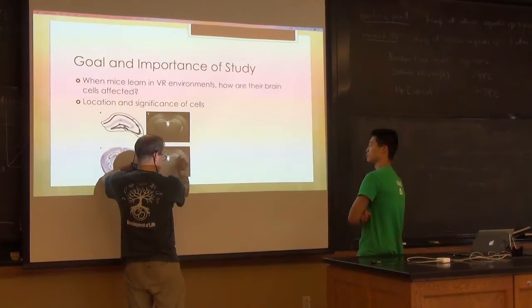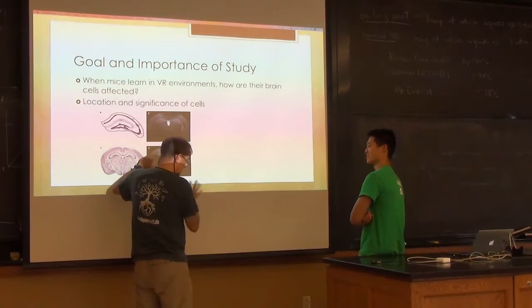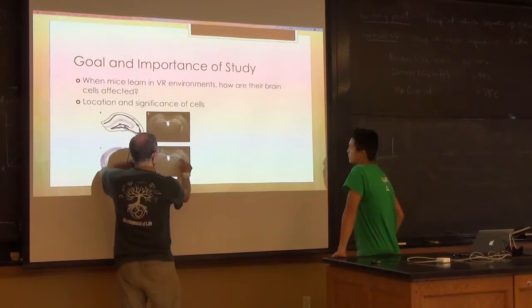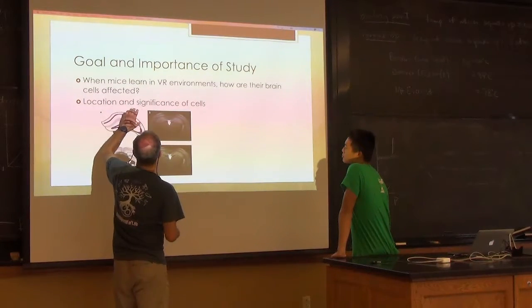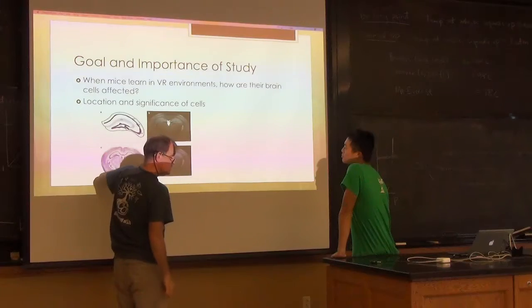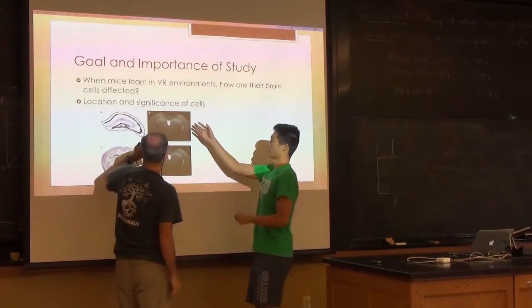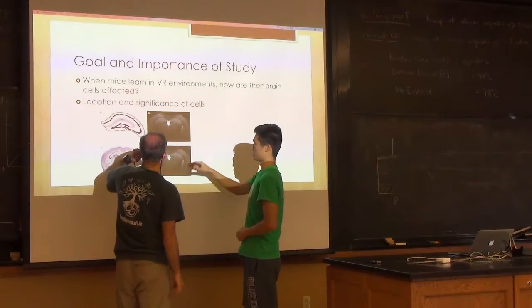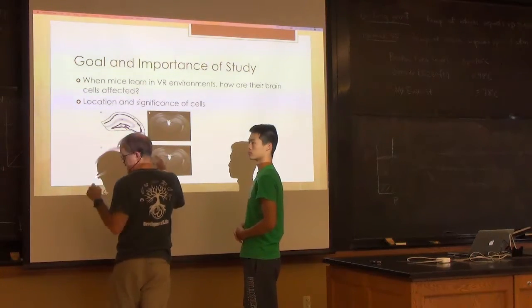This is really subtle to me, and I'm used to looking at tissues, though not brain tissues. So if you're going to say, here, this is normal, unstimulated, stimulated, or something? What is it? So the FOS expressing cells would be labeled darker. Right. But why are they activated here?